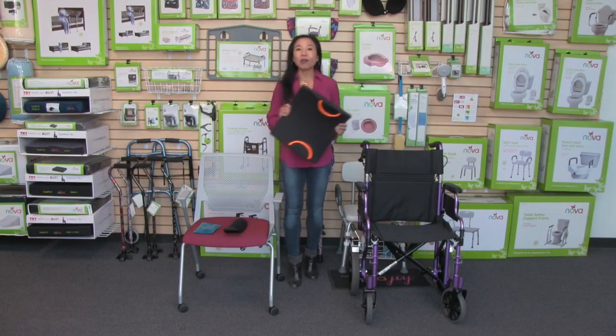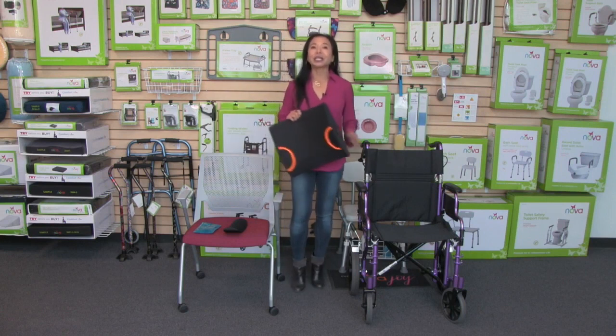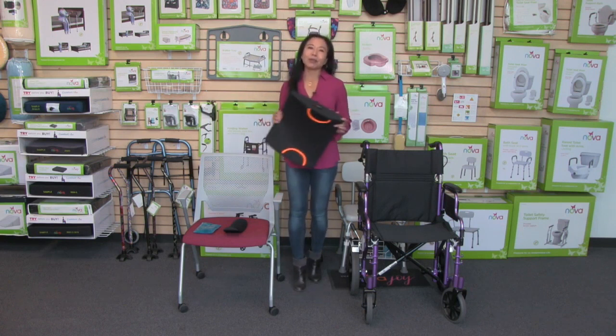Hi, this video is about the Nova lumbar back cushion with hot and cold pack and lumbar support. This really is the ultimate lumbar cushion.